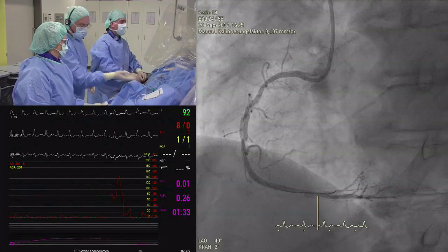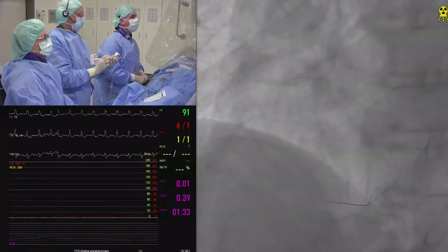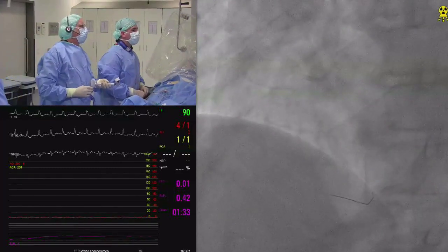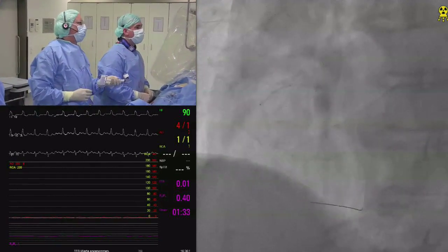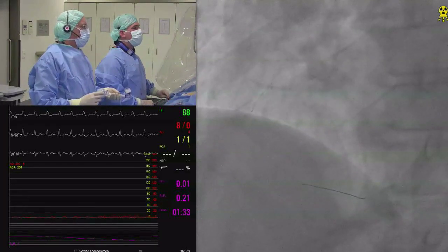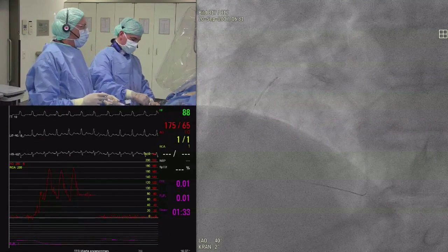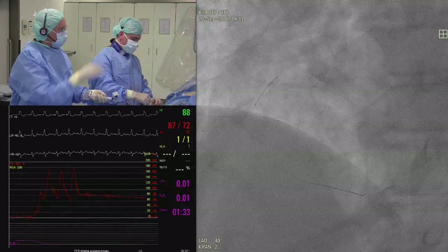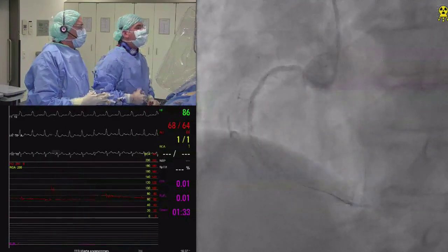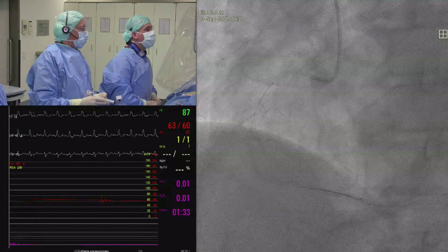I got it. This is all rapid exchange equipment. So that seems to slide in easier than the balloon did. Your balloon did a fantastic job there, for sure. Thank you. Yeah. So now we're concentrating on the distal tip to make sure that it's where we want it, and then we're going to allow the back end to go where it lays. So it looks like it's in a little far now.